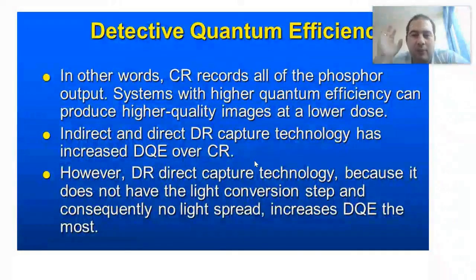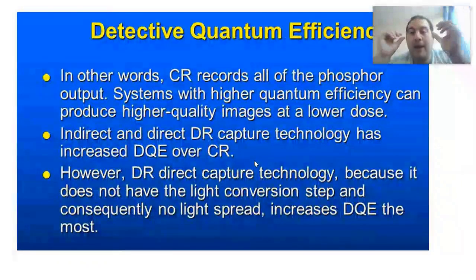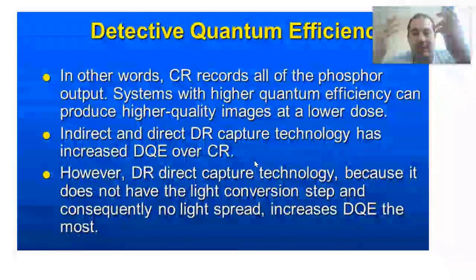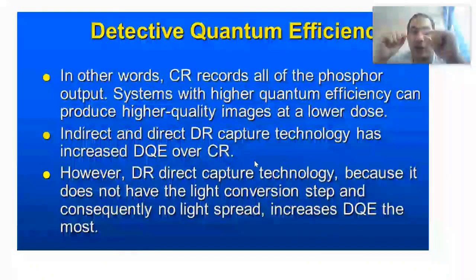When I say, for example, sometimes when you come, Huda, let me give you an example. You have seen CT images, right? How does the image look to you in pediatric cases when we consider the dose? If a high dose is given in a CT image, the image will be very clear and you will feel that the image is excellent.